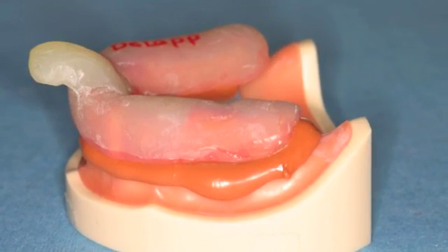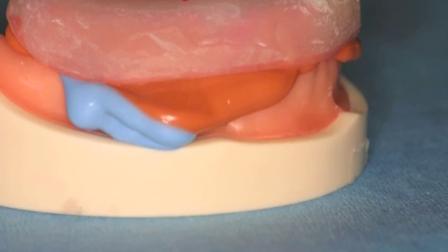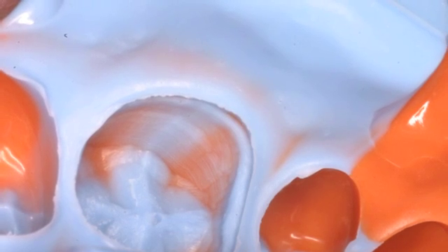After setting, remove as straight as possible. Rinse blood and saliva in a patient setting, blow dry, and inspect.